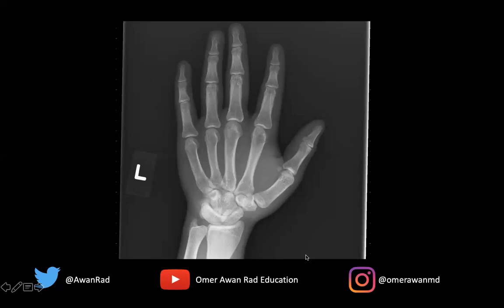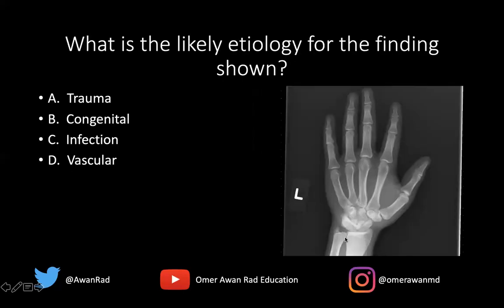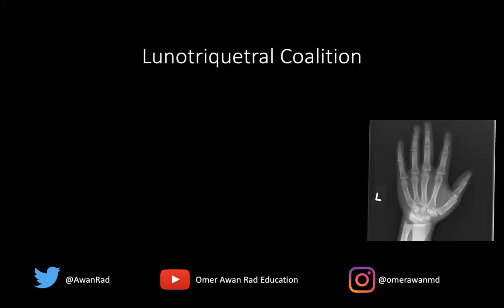The question is: what is the likely etiology for this finding? Is this lunotriquetral coalition from trauma, is it congenital, from infection, or from vascular causes? The vast majority of lunotriquetral coalitions tend to be congenital. This is probably the most common carpal coalition that we see.